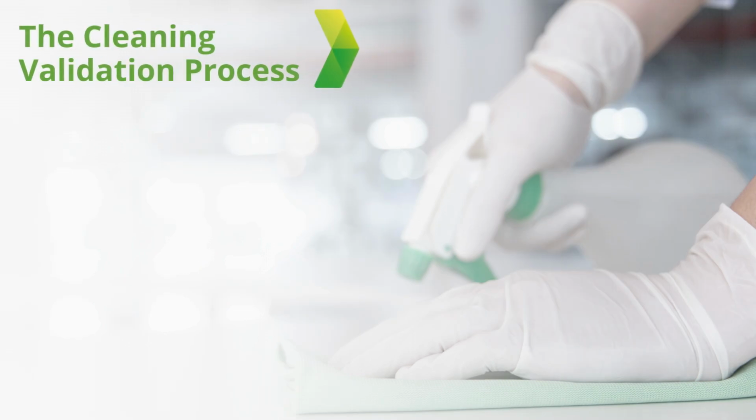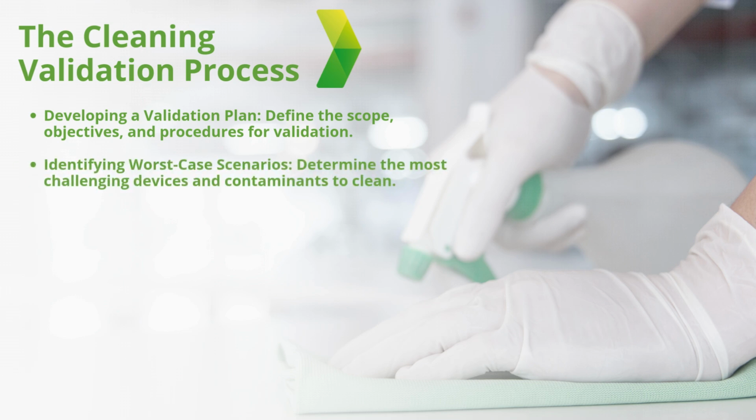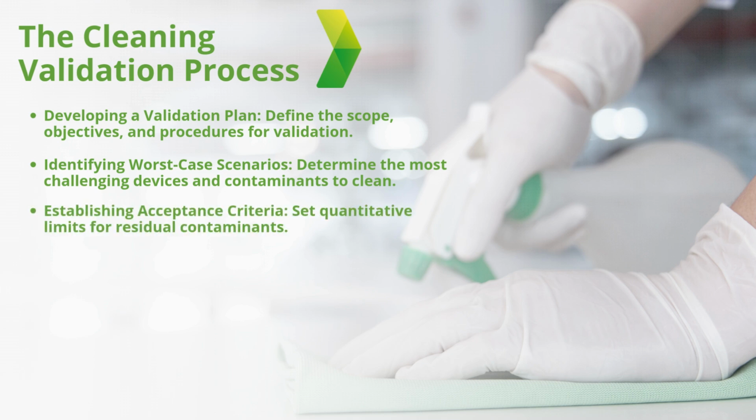The cleaning validation process involves several key steps. 1. Developing a validation plan. Define the scope, objectives, and procedures for validation. 2. Identifying worst-case scenarios. Determine the most challenging devices and contaminants to clean. 3. Establishing acceptance criteria. Set quantitative limits for residual contaminants.